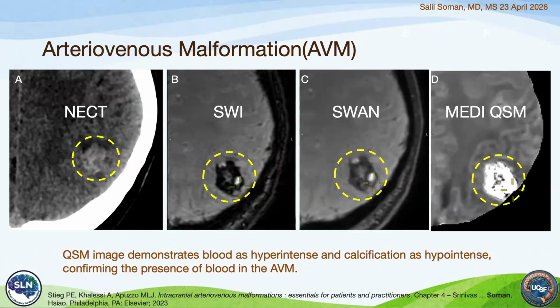Oh no, gosh, that's a great question. Okay, so non-contrast head CT, right? That is one kind of machine, right? Okay. All three of these images, right? It's all from the same scan. On this MRI scanner, you scan them once. That raw data, so long as you have the raw data, you can make all these different things. So as a clinician, you could choose.